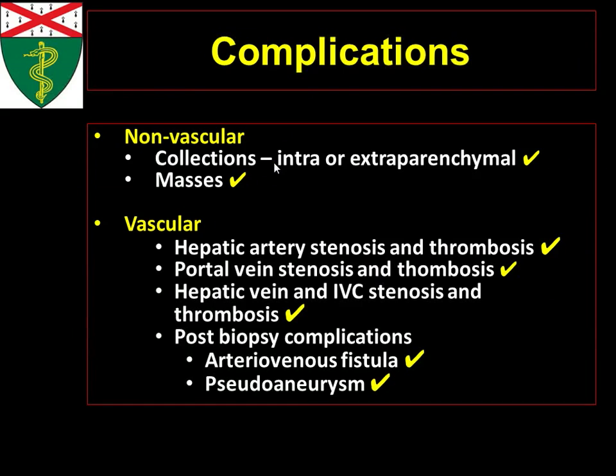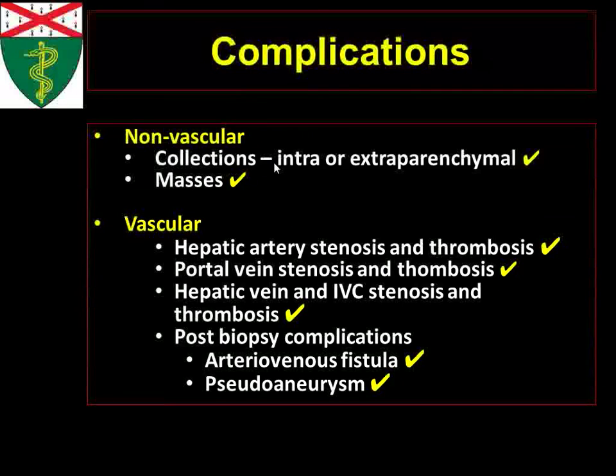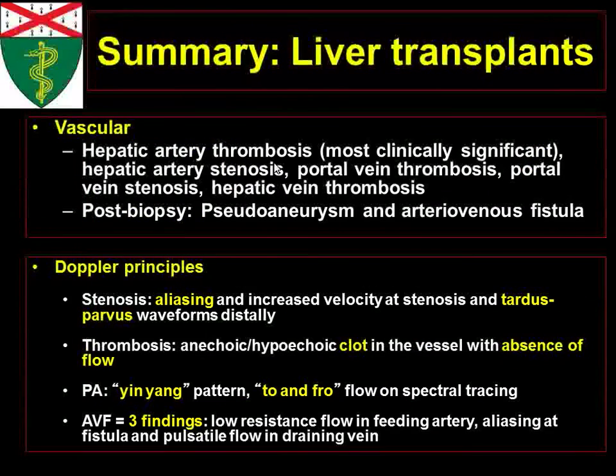And so now we've basically gone through all the complications. There's not much more you'll see that doesn't fit into one of these categories. If you're able to understand the general concepts of why things look a certain way when they're complicated, then I think you'll be fine. And this is essentially the summary of all the vascular complications I want you to remember.